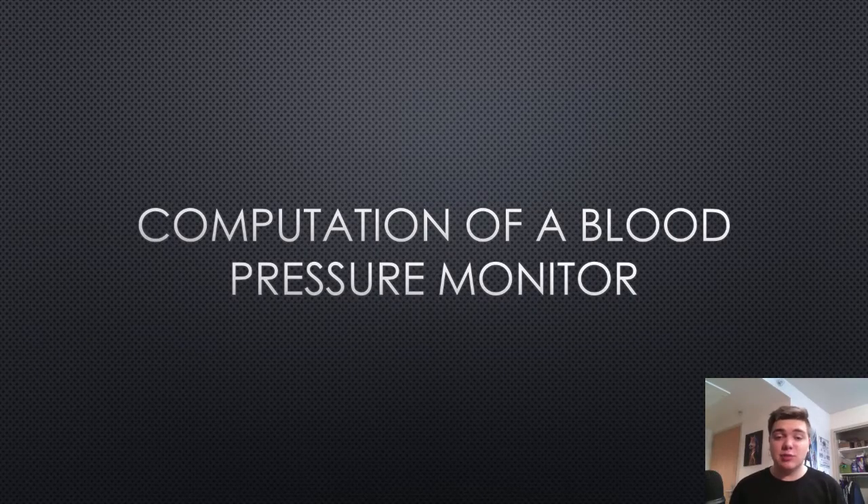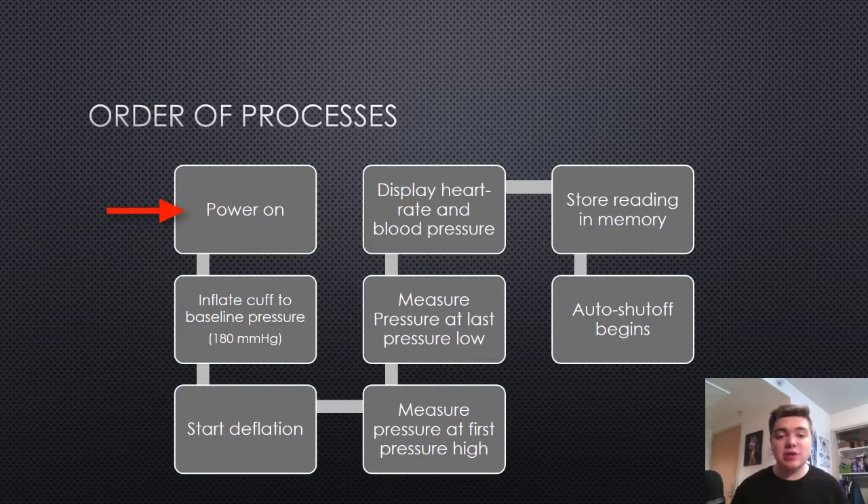So, how does a computer inside of a blood pressure monitor actually work? Let's find out. When you first turn on the machine, it begins to inflate the cuff to a baseline pressure of 180 millimeters of mercury. Then, the computer sends a signal to the valve to begin deflating the cuff at a steady rate.